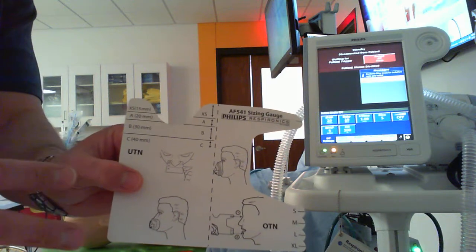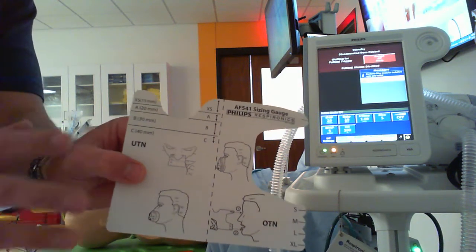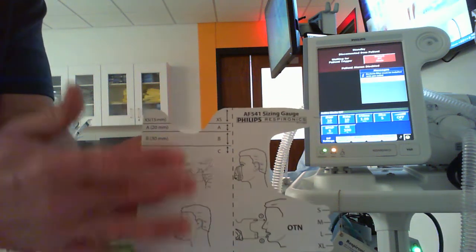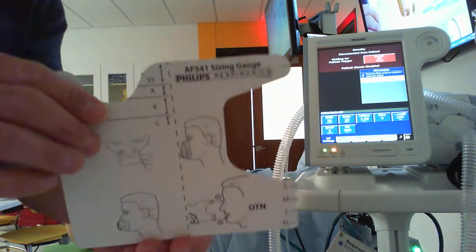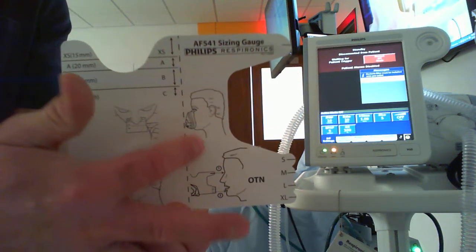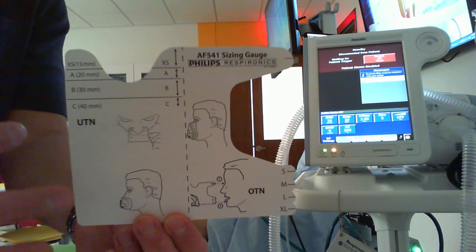Some of these are cut into the actual packaging of the mask. Some places you'll have like a laminated card. With the current Philips Respironics mask, they give you this paper piece that's inside of the mask or your interface bag, and then all you have the ability to size for a full face mask, so covering the nose and the mouth. And these are a very useful sizing guide for what we call an under nose cushion.